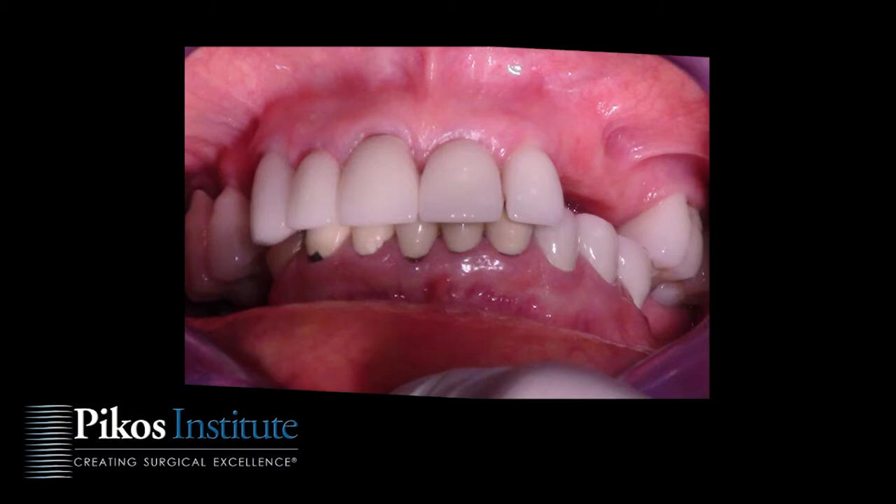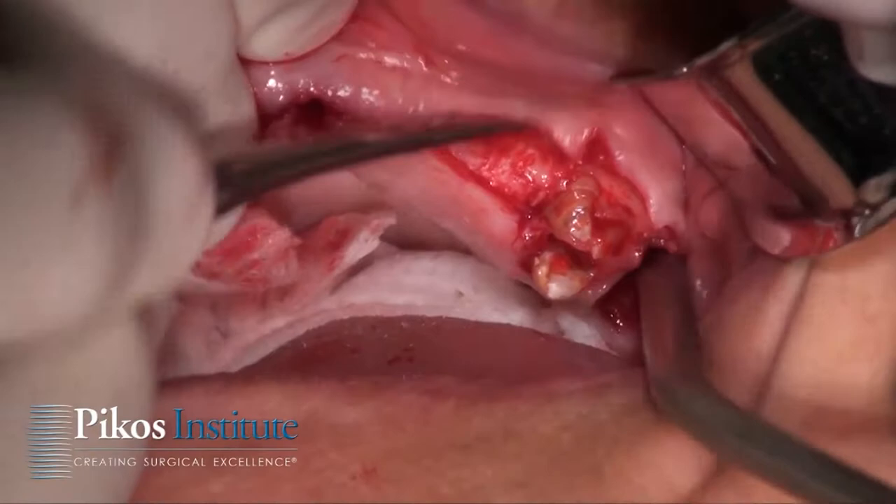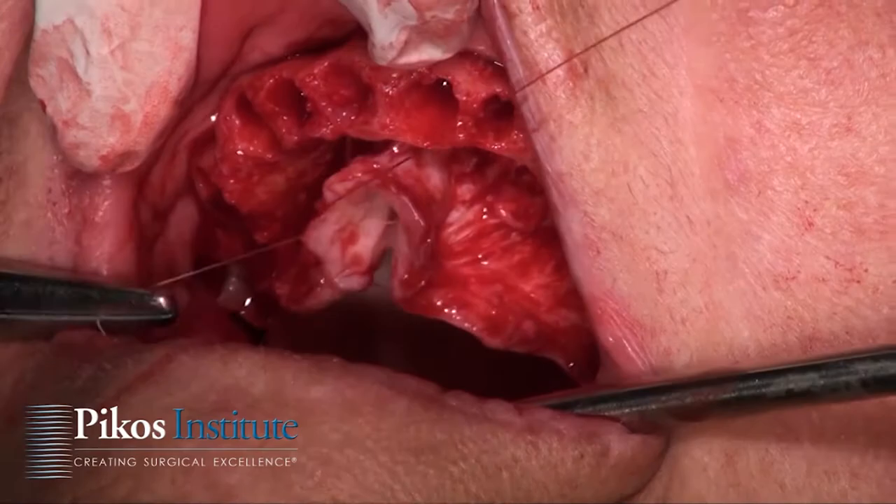So let's look at this video clip. This is a patient in her late 50s who came to us with what we call terminal dentition — just some remaining maxillary teeth that are not in good repair. As you're seeing here, we're addressing the maxillary arch with a full flap reflection.